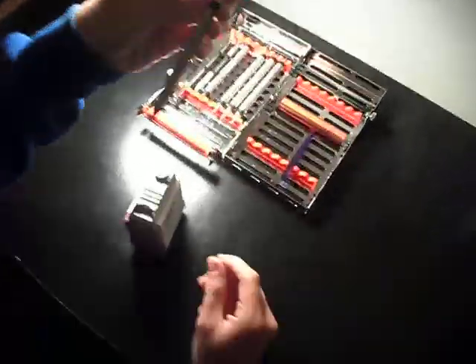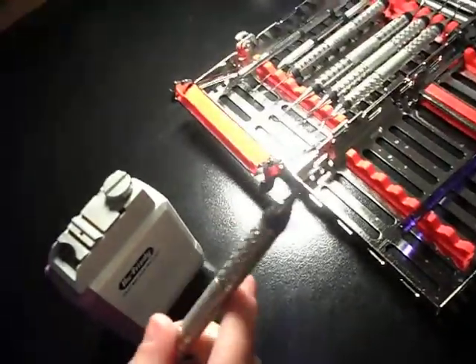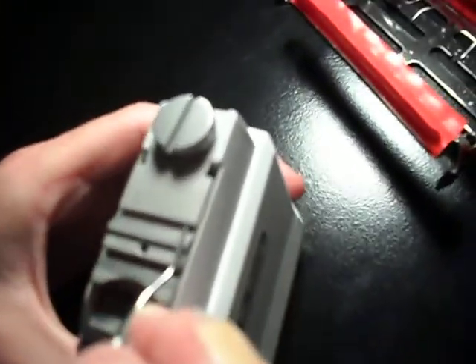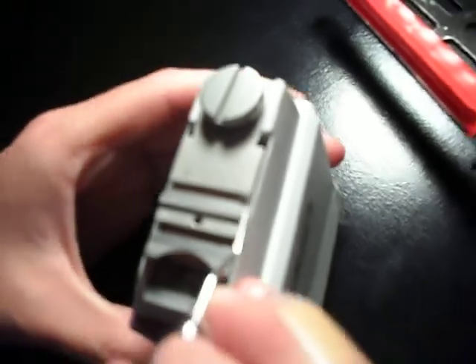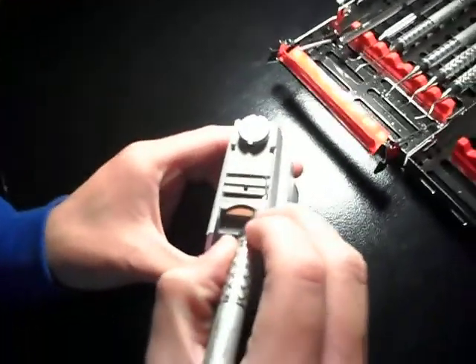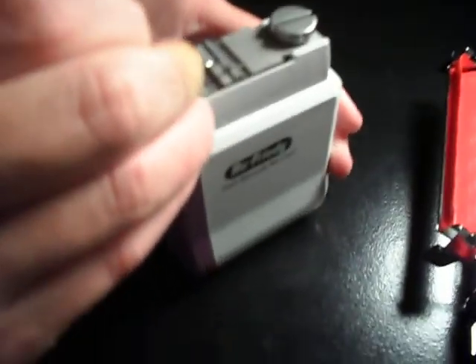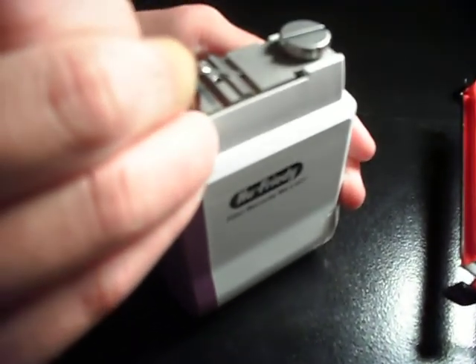which is on the crowns of the teeth. It helps remove the calculus on the crowns of the teeth. And this is our Gracie, our subgingival or below the gum line instrument. What you want to do is put the lower side of the Gracie on the G plate, turn it on, and do the same thing 2 to 3 times.